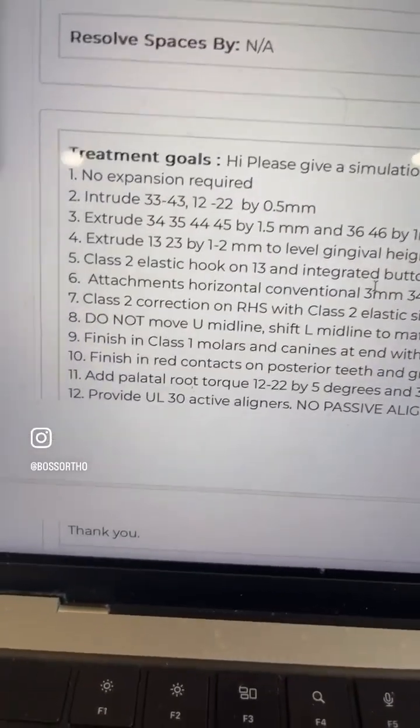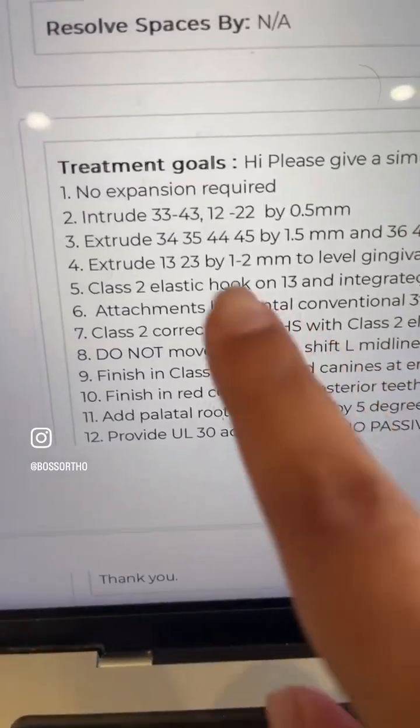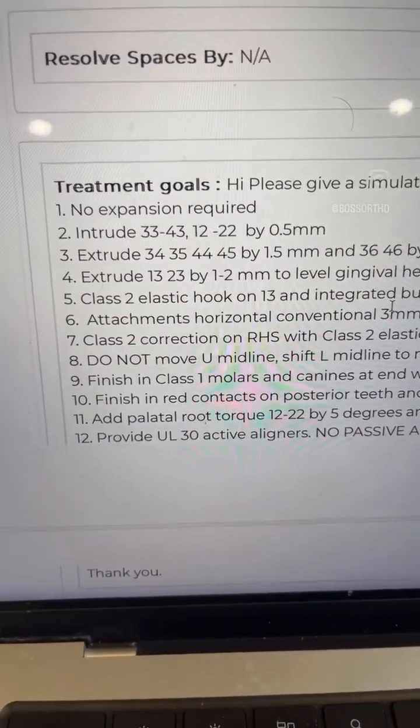So let's look at how we're going to instruct the technician what to do. Right, I'm doing Spark aligners. This is a refinement set. So really I'm telling them exactly what I want. I'm saying, hey, I don't want expansion. I think there's enough adequate expansion.